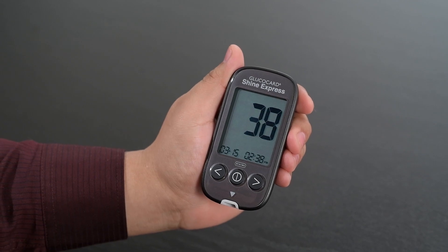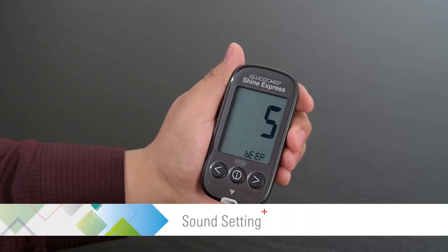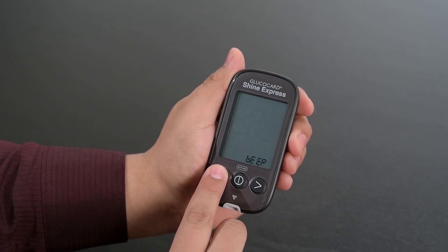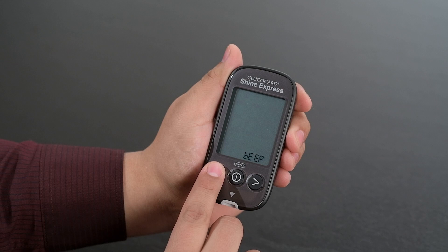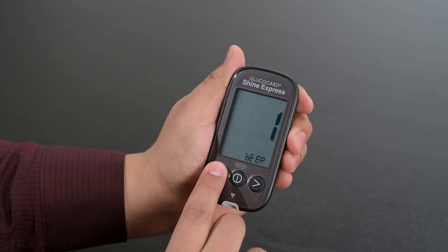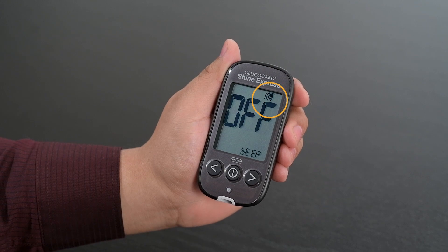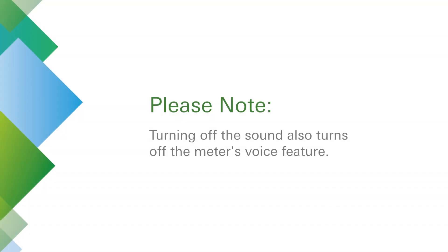Then press the center button to proceed to the sound setting. Use the left or right arrow buttons to turn the sound on or off and to set the volume. When the sound is turned off, a mute symbol will be displayed. Turning off the sound also turns off the meter's voice feature.